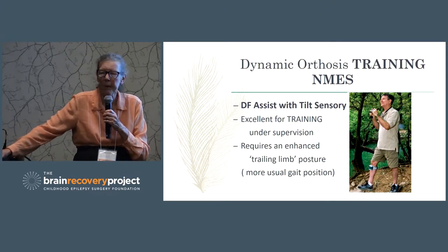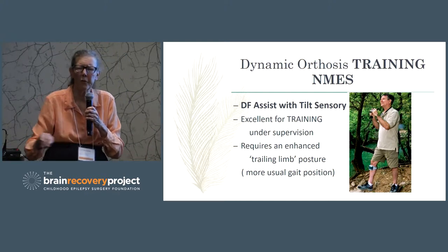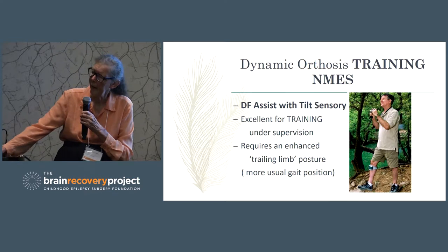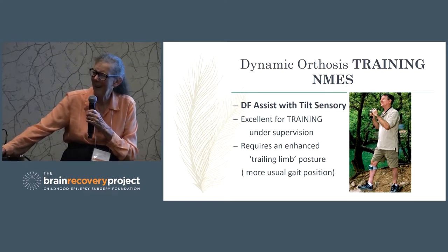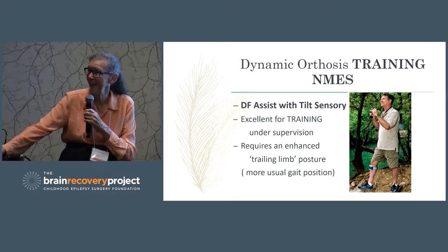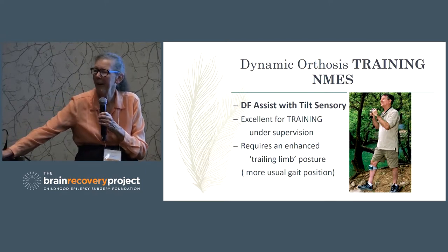How many of you have tried looking at one of these dorsiflexion assists? And what kind of price tag did you get? We were actually the first ones that our insurance decided to cover. Oh, good. Excellent. So that's lots of letters. Yes. So I don't know exactly. Yeah.